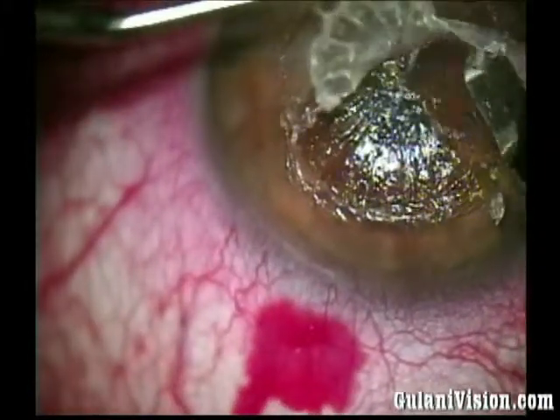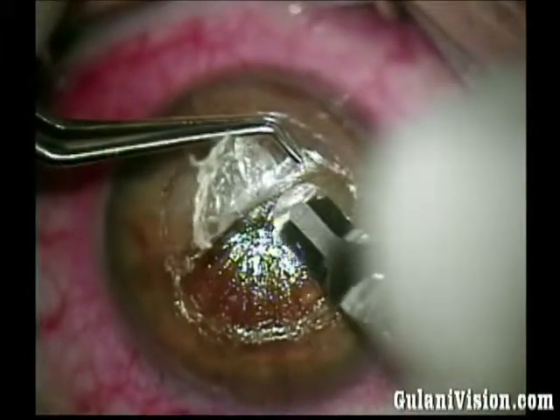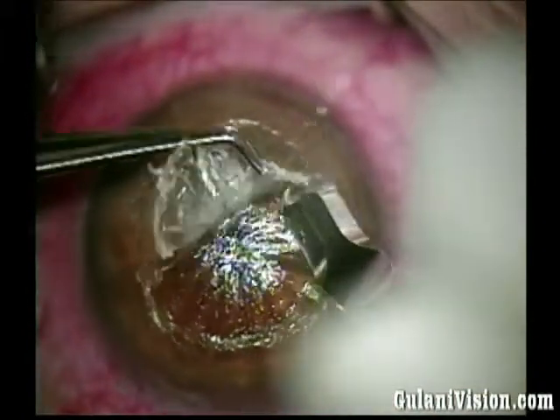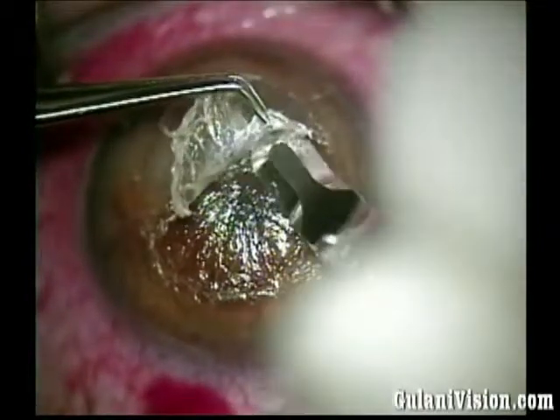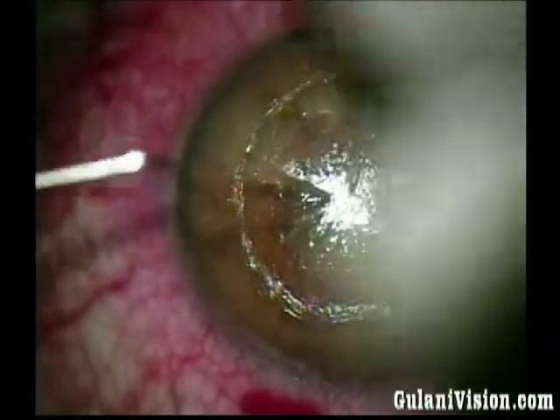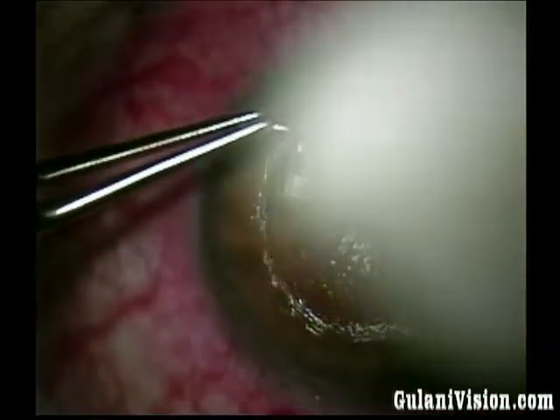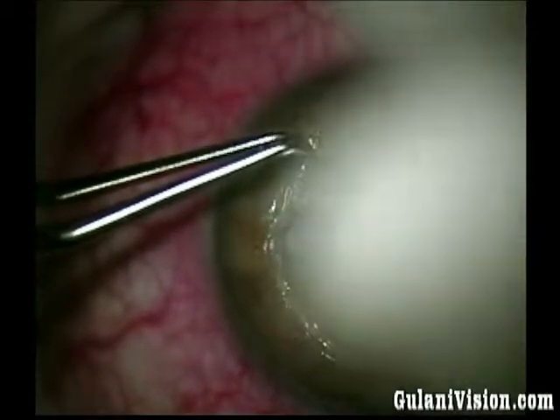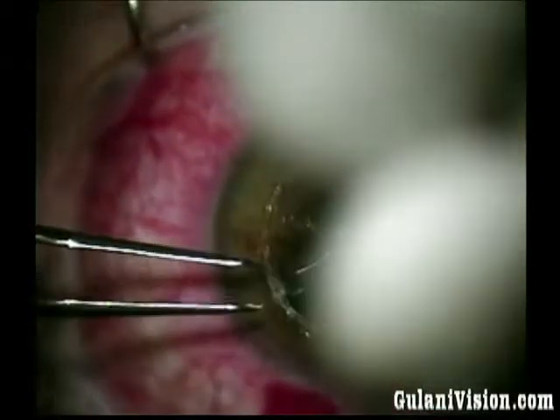I gently hold this lamellar tissue as I dissect using less resistance and more spatial separation, seeing my plane below smooth enough to proceed with lamellar keratoplasty eventually. Gentle and easy — these arcuate incisions truly look like they'll open up any minute. No wonder there was this deep scarring. I am now preparing the peripheral pocket, keeping all principles no matter how difficult for future success.